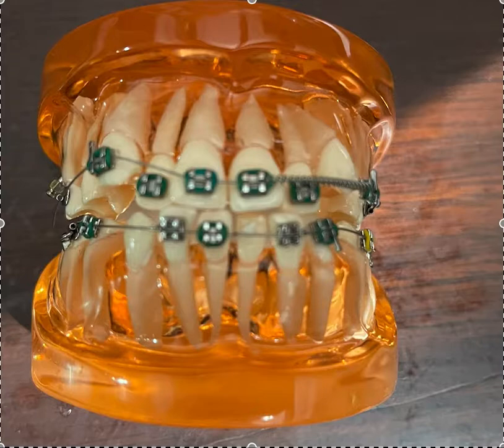Specifically 022 versus 018 slot, and the whole Roth, MBT. There are so many different prescriptions, and I have a whole different video on the prescription part, the Roth, MBT, all that. But today I'm specifically going to talk about the slot size, picking 018 versus 022. And really it comes down to personal preference and how you were trained, and probably what they used in your residency or what they used in your class that you took. You just do what's comfortable for you.